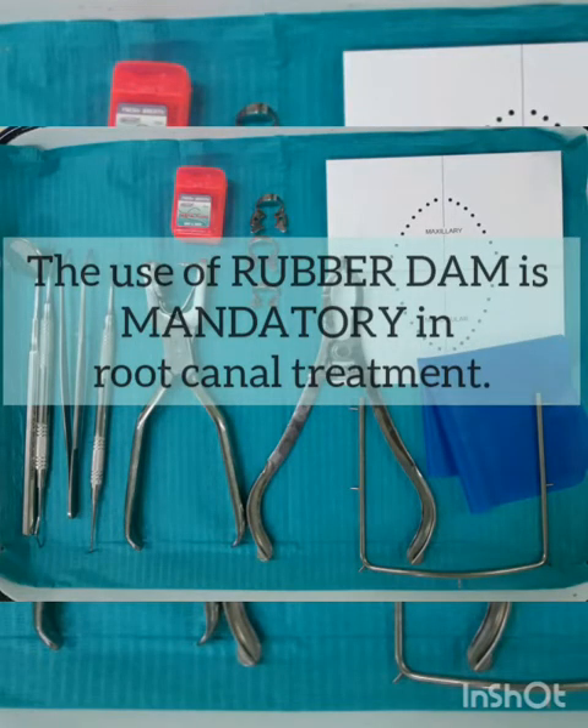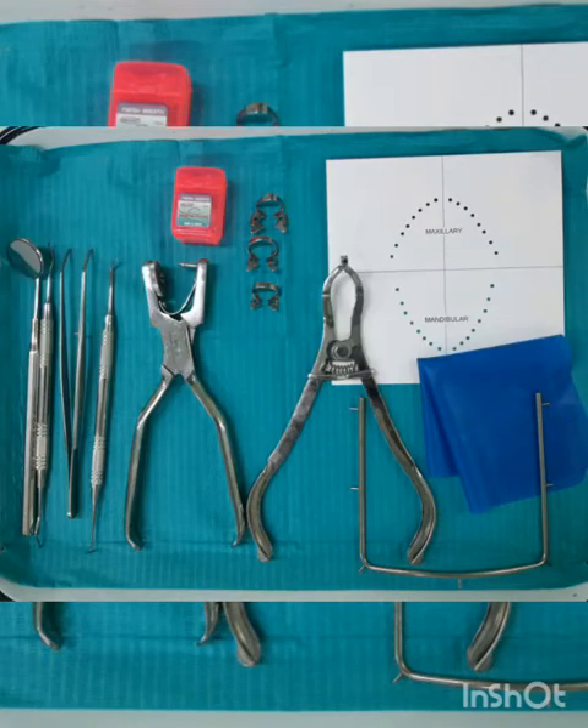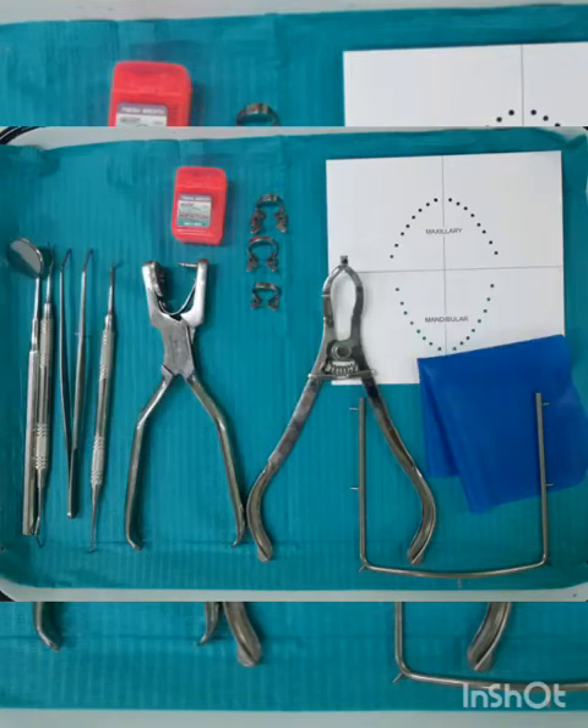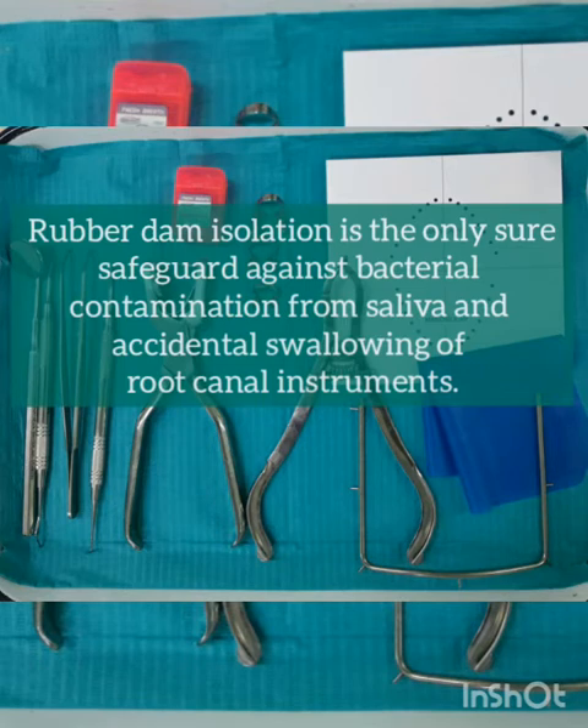The use of the rubber dam is mandatory in root canal treatment. When properly placed, the rubber dam facilitates treatment by isolating the tooth from obstacles that can disrupt any procedure. Proper rubber dam placement can be done quickly and will enhance the entire procedure.